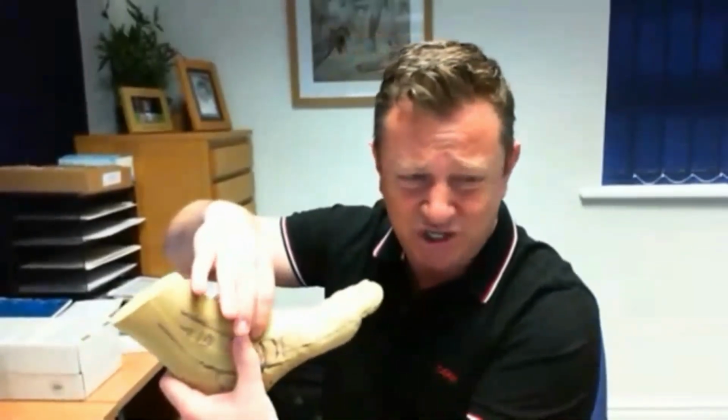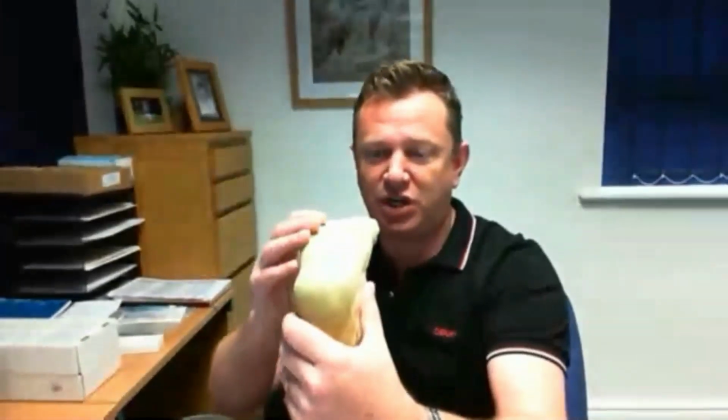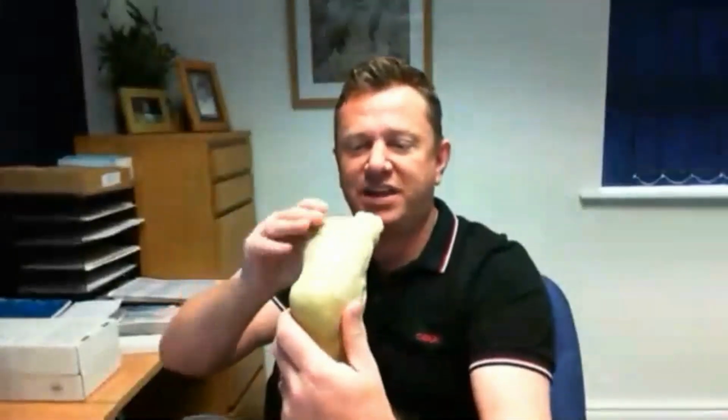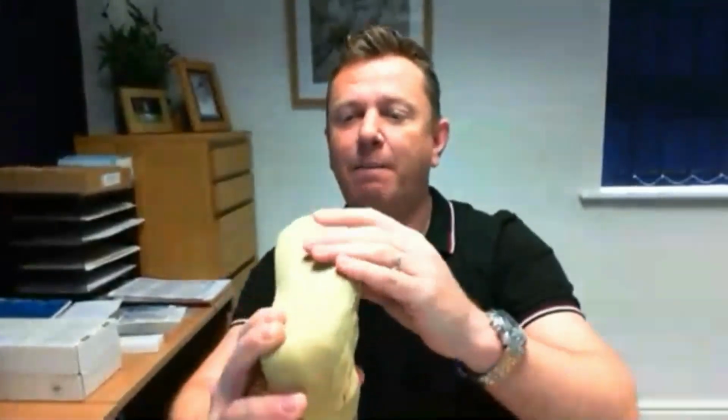Okay? You think you can, and that's great, but you're palpating a position that is just really hard and unreliable to palpate without going through plaster in the first place or a scanning material. If you're 3D scanning it, then fantastic, you can get this foot into a position, but I would argue we need to be thinking about modifications like skives to compress the heel to restrict subtalar motion, wedges laterally, built into the thing.